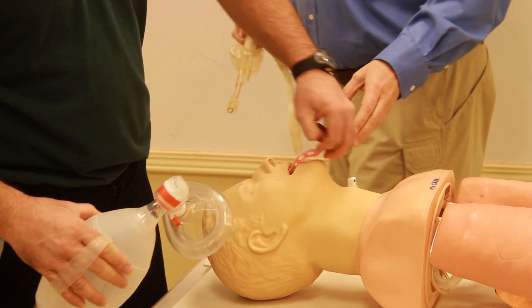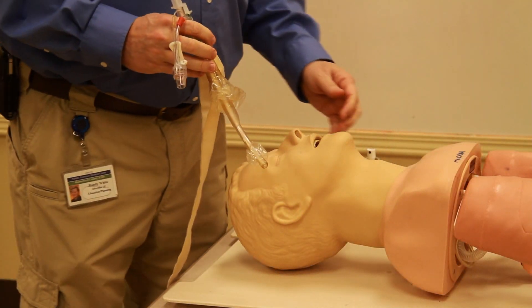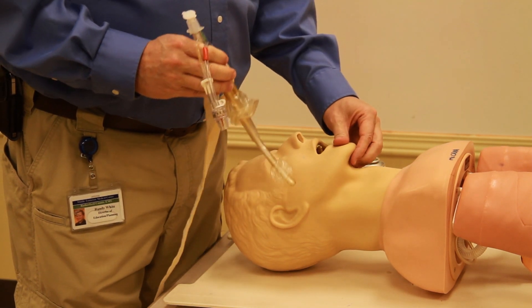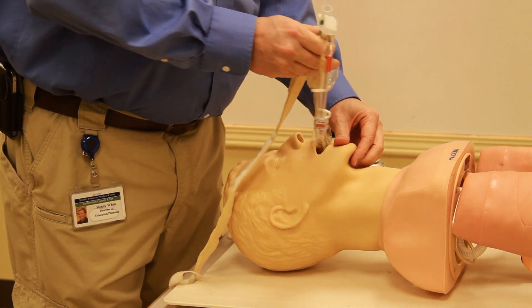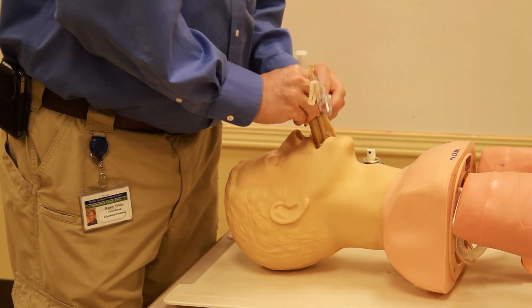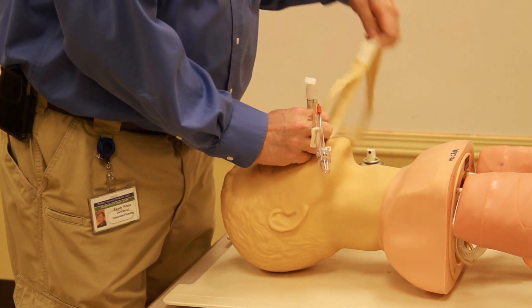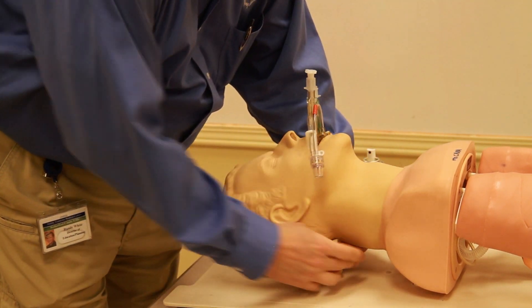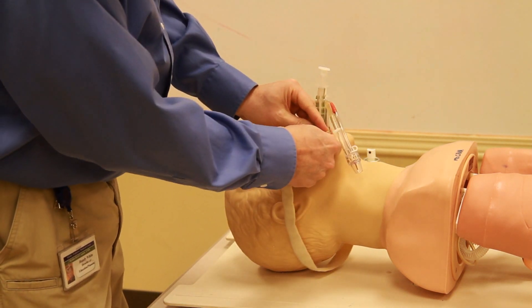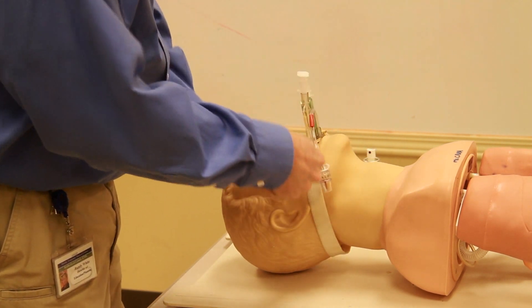I have 30 seconds to put this airway in. I pull the chin down and push the airway in following the curvature of the mouth. Then I wrap the neck strap around the neck, through the airway, and back down.